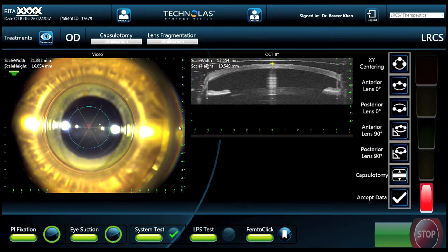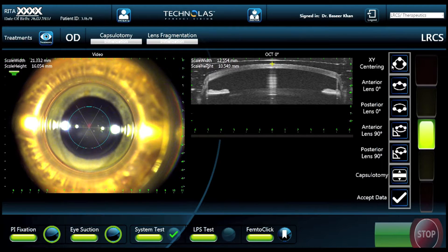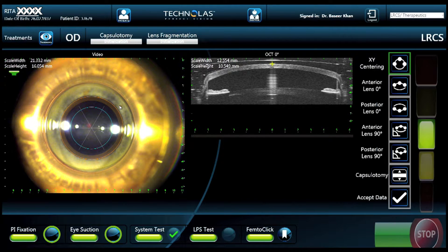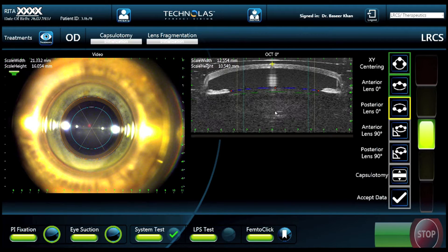Once we've reached the middle of our pressure sensing range, we lock the suction cup in place and there will be no more movement of the eye. This allows the technician or surgeon to start marking the margin of the pupil using three points, which delineates where the capsulotomy is going to be performed. Then we look at the OCT in the middle of the screen and mark the anterior surface of the capsule using three points.